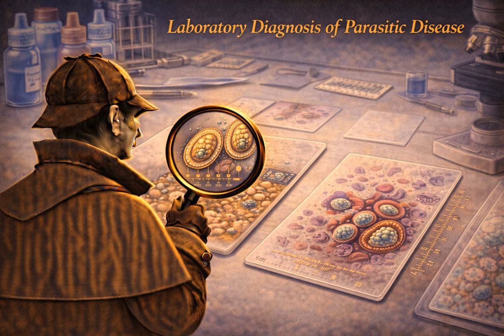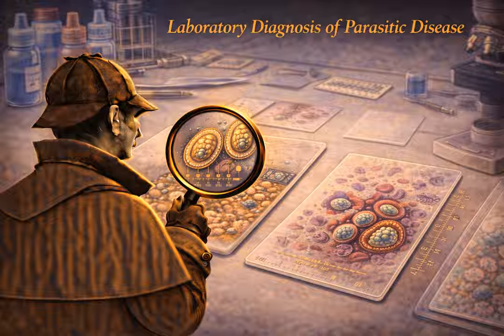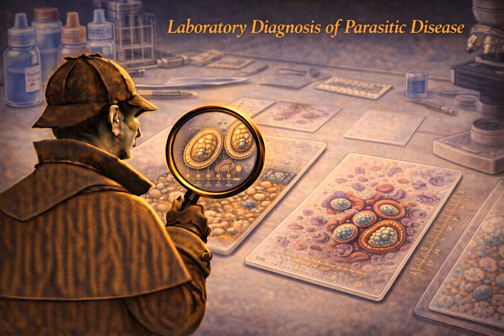And you mentioned iodine earlier in relation to this step. Right, you can and usually do a second wet mount right next to it using a drop of Lugol's iodine. Now, iodine is a double-edged sword. It stains the internal glycogen and the nuclei, so it makes the internal structures really pop visually, but the iodine kills the organism instantly. So you lose the motility. Exactly. So the rule is saline to see the movement, iodine to see the internal structure.